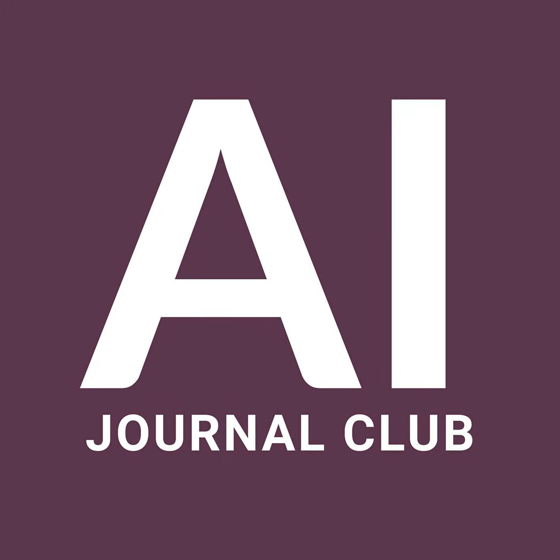It provides nuance. A faint heat map hovering over a mask suggests, hey, I'm guessing here, while a bright red one screams, look at this immediately. And that transparency is so crucial for building trust. If the AI is just a black box that spits out the word cancer, a doctor will be naturally skeptical. Naturally. But if it shows its work, if it says, I see these specific patterns here and here, it becomes a collaborator rather than a dictator.